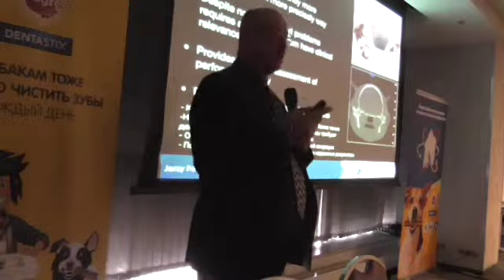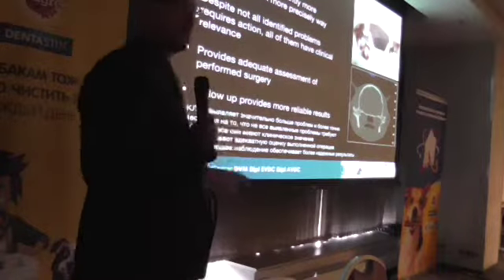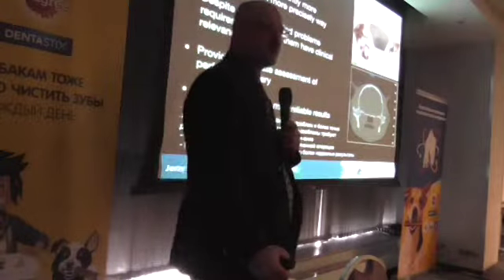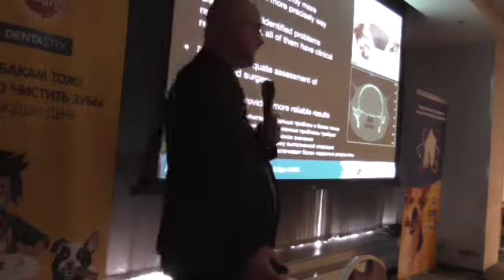Okay. That's a really important thing. And in any head trauma patients, we currently apply the standard of 3-dimensional imaging, particularly the high-rise syndrome in a cat, which will be the last lecture today.